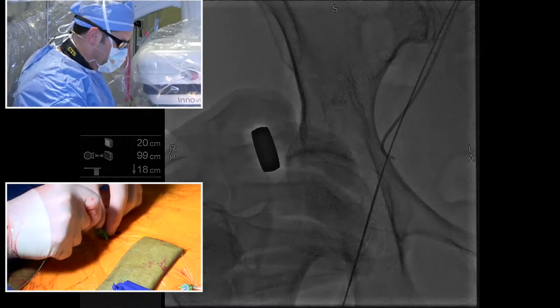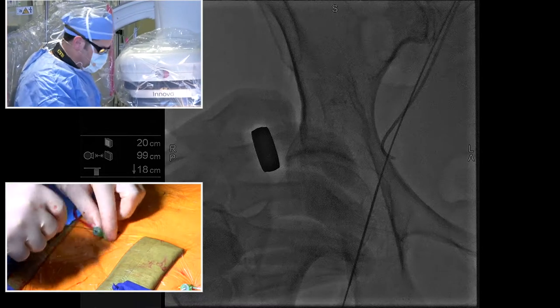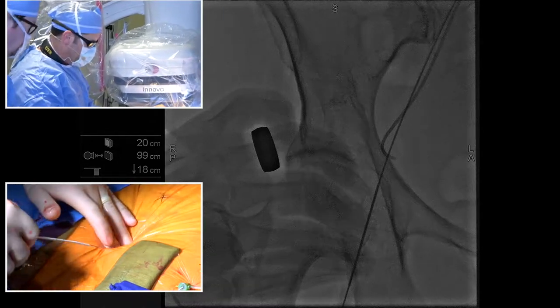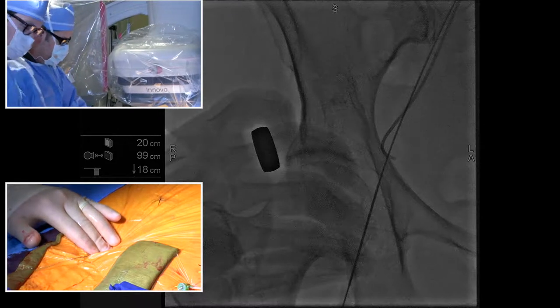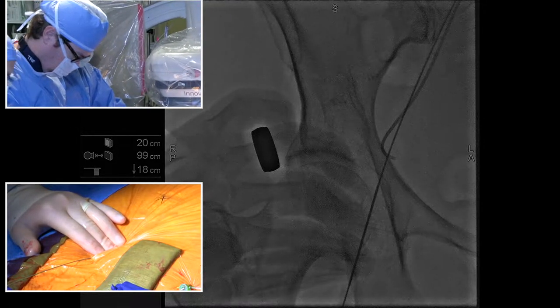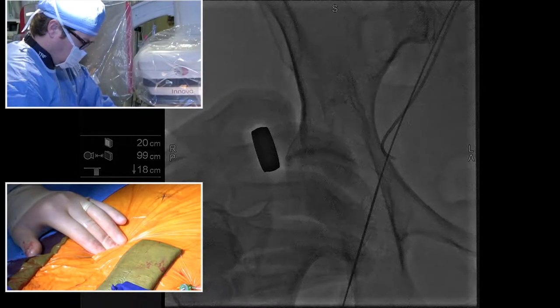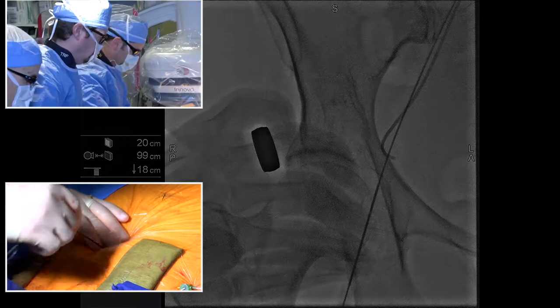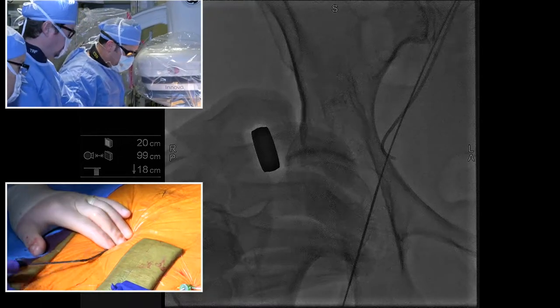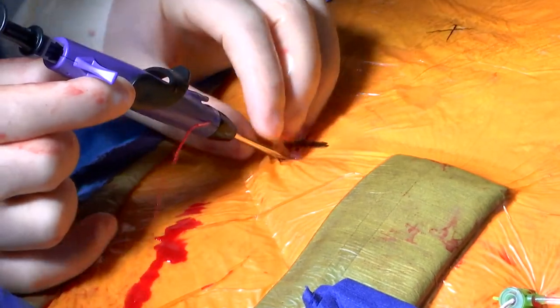So I'm going to put a wire in here. There we go. I'm going to put a wire in the sheath. Walk the sheath out. Hold a little bit of pressure. Ray's going to help me. Put the first device in. Perfect. And this just goes into the artery, and once I get to a certain depth, we're going to remove the wire. I'm going to push this in until I get flow coming out of this little marker port on the side. That tells me I'm in the artery.